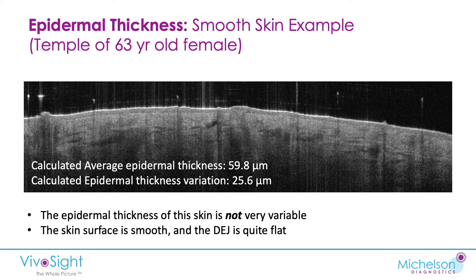Contrast that with this next example: the temple of a 63-year-old female. You can see straight away that her skin is a lot smoother, and the DEJ is actually very, very flat. Her epidermis is thinner at just under 60 microns, and the epidermal thickness variation is 25.6 microns — a lot lower. That's normal as you get older: the DEJ does tend to flatten out, and you lose those rete ridges and so forth.